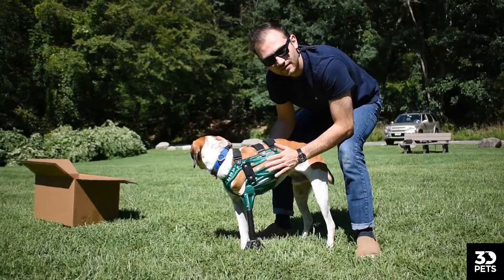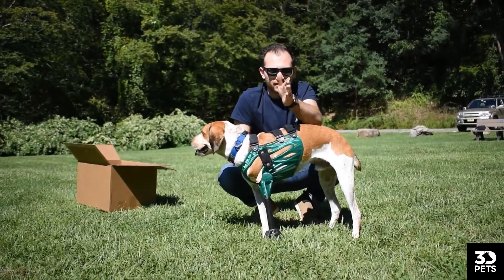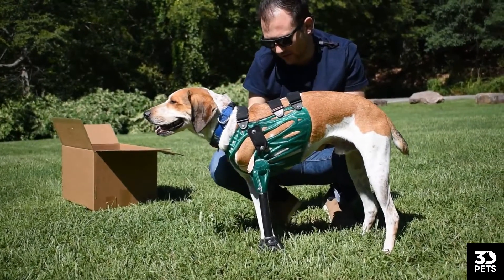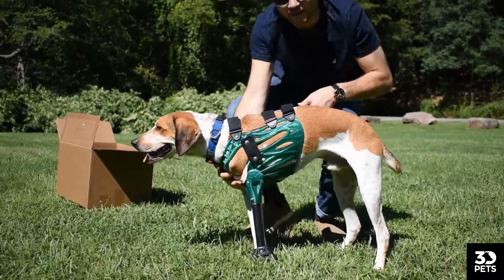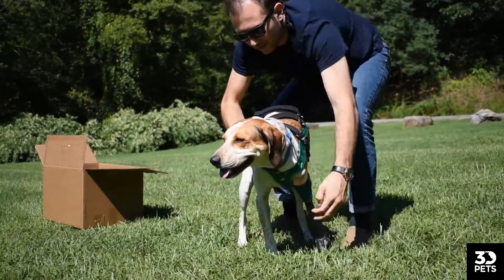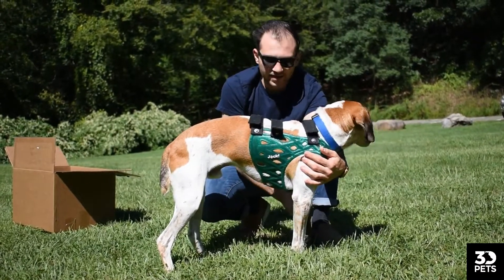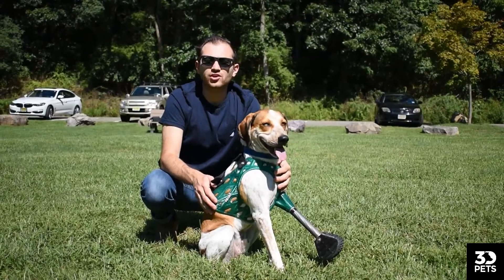We've adjusted this leg for Jack and we may have to make adjustments to yours — this is why these photos and videos are so important. The way we're facing right now, this is exactly the type of shot that we want. We want a side shot heading straight on to him, making sure we can see this angle and see the foot. Clear photos are really important. The next photo we want is facing straight on with your pup, and then on the other side. We want to know exactly where this leg is sitting, how far forward it is, how far backward it is.